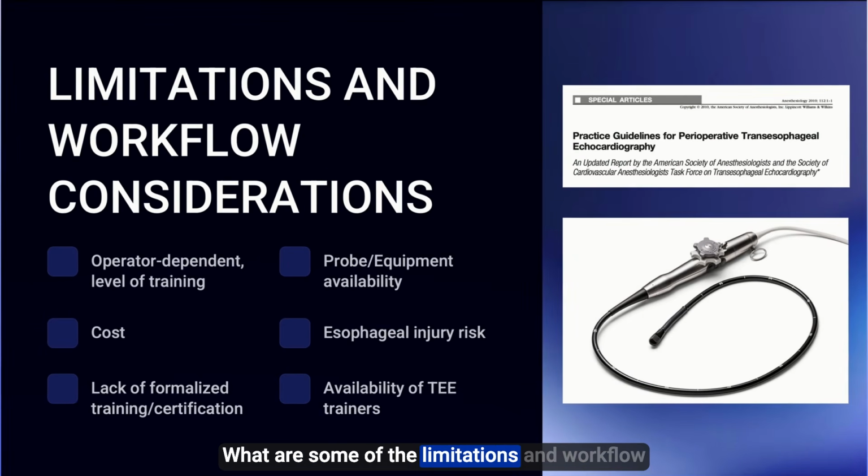What are some of the limitations and workflow considerations that you need to keep in mind if you're thinking about having a Rescue TEE system? The usefulness of this system is that it's operator dependent on the level of training. People that have undergone more training and more intensive learning programs oftentimes see more clinical benefit. Probes and equipment are frequently unavailable because they're costly, so keeping them in every operating room is not great resource utilization. However, the more available this equipment can be, oftentimes the more helpful it is.